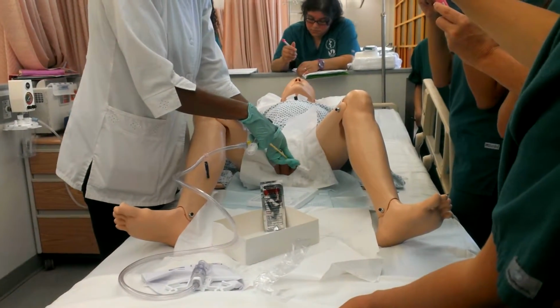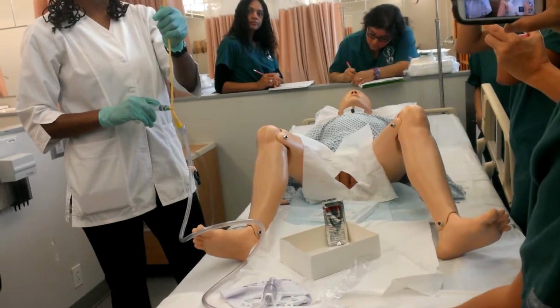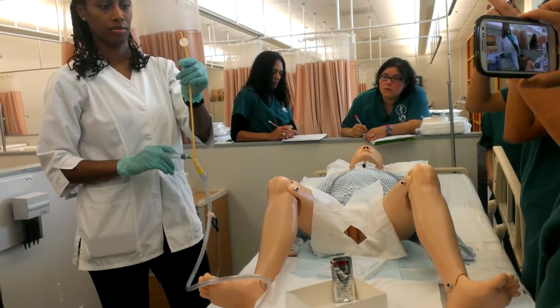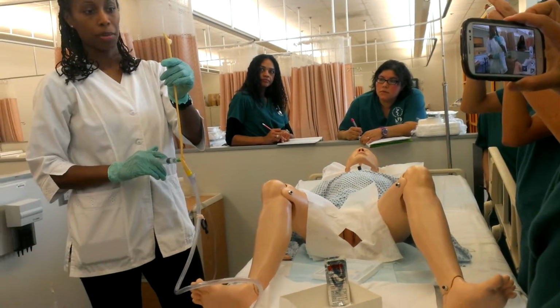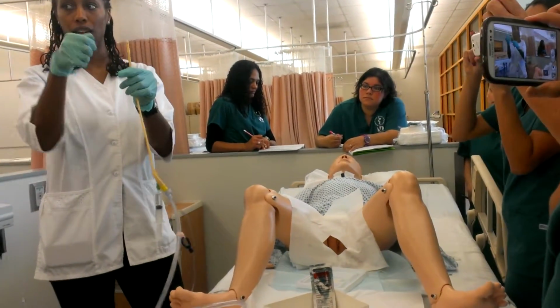In, out, and when they breathe out, you just pull out. That's it. So this is what the balloon looks like on the inside. That's what makes it get stuck in there. But how would you even know it's doing that inside? Because you kind of pull back and you'll feel it. If it doesn't inflate, then it'll just come out.